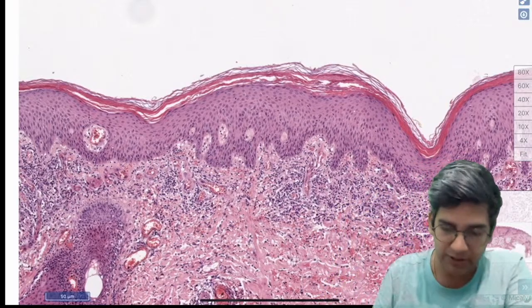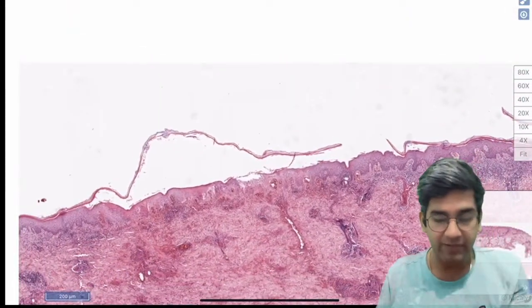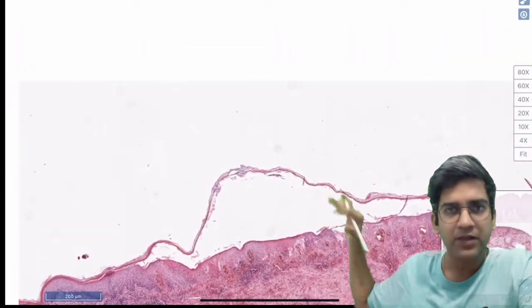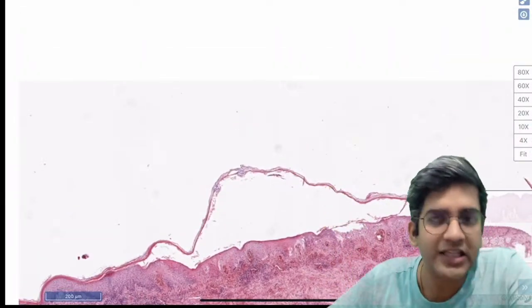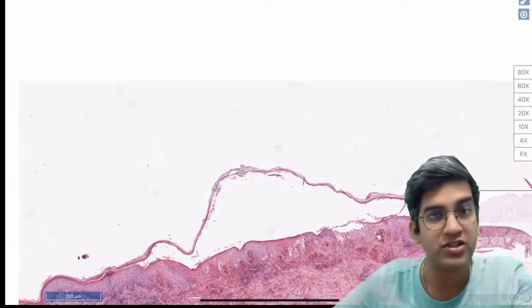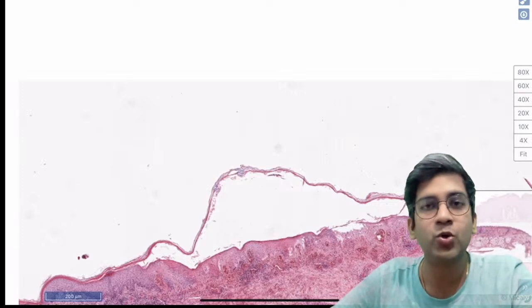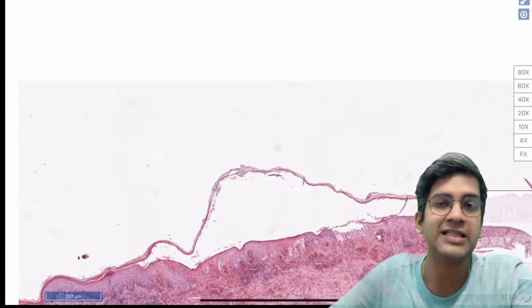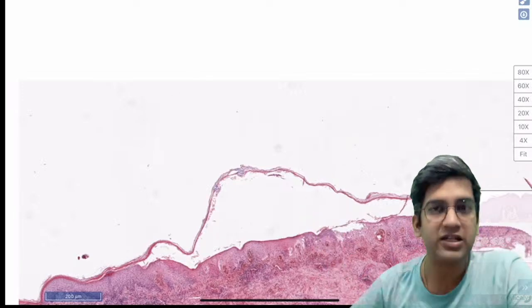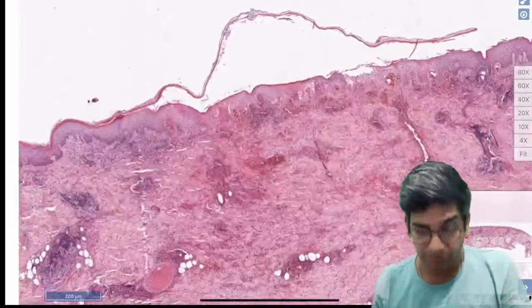Hakim, I'll come back to this. Okay, like I said, there's a broken one here. I am thinking, Hakim, you're worried about this part. Maybe you're thinking it's a bullous disorder. I'll tell you, clinical diagnosis, differential diagnosis is not a bullous disorder. It's an artifactual separation here. Since I don't clinically see a bulla, since there is no bulla mentioned in the form, let's ignore this for now. It's an artifactual separation which has come due to processing of the tissues, fine. So let's ignore that point for now, right?